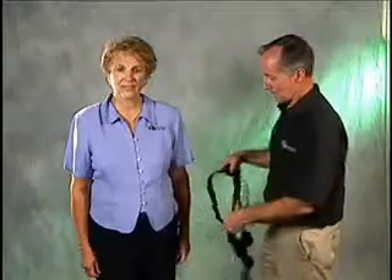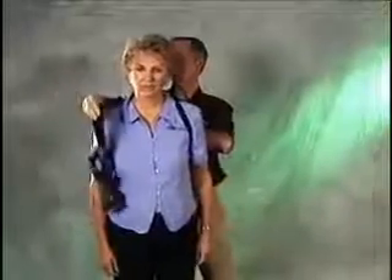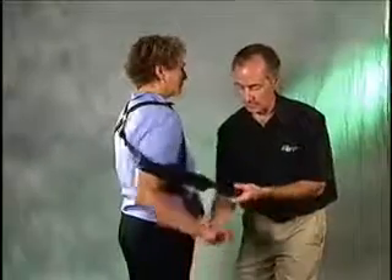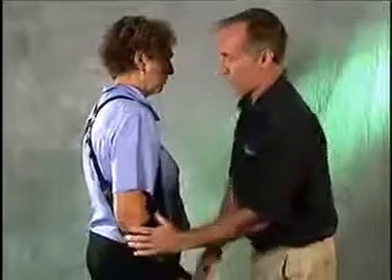In donning the sling, have the client put their uninvolved arm through the loop of the shoulder harness, and lay the sling across the back. Then before you place the elbow in the sling, take the flaccid hand and place it in the hand piece of the Give More sling. Then allow the arm to hang down by the side and pull the elbow strap around the elbow.